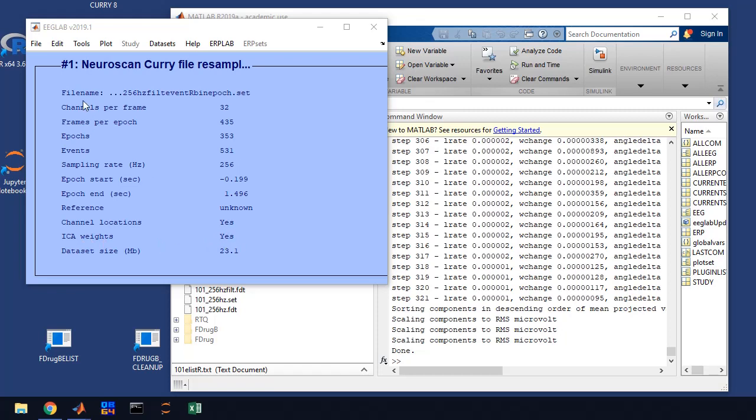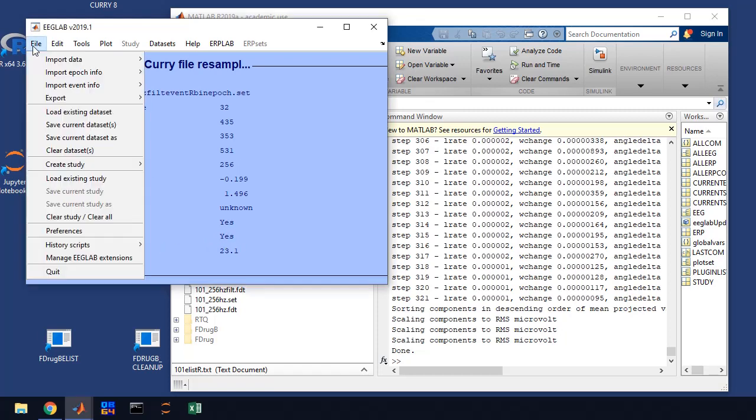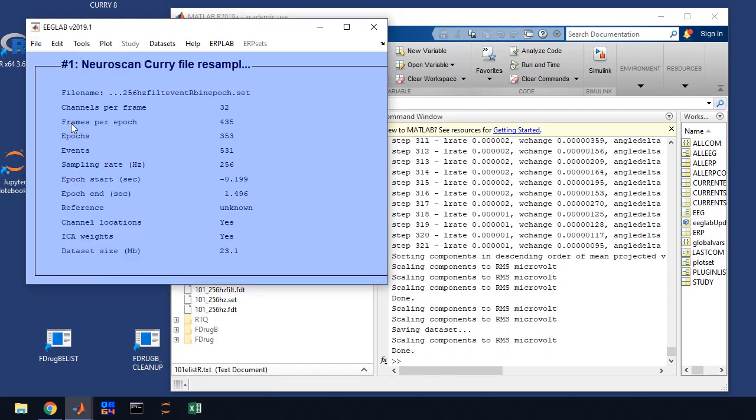So at this point, what I want you to do is go ahead and save the current data set because that will save the ICA waits. A lot of times if we have to go back and reprocess some data, it's generally to this step where we're removing artifacts. So if you save it here, we won't have to rerun ICA and save that time that it takes to compute it.